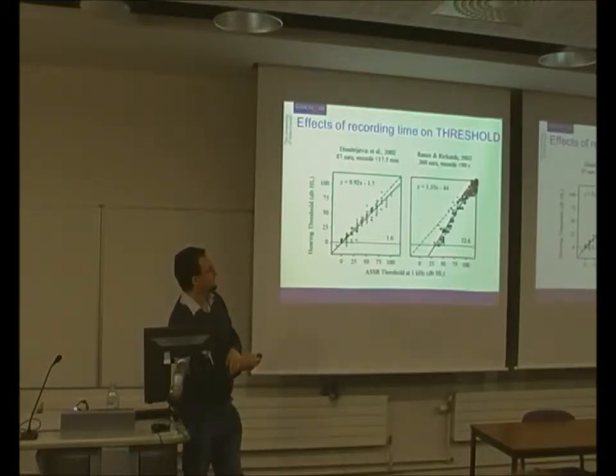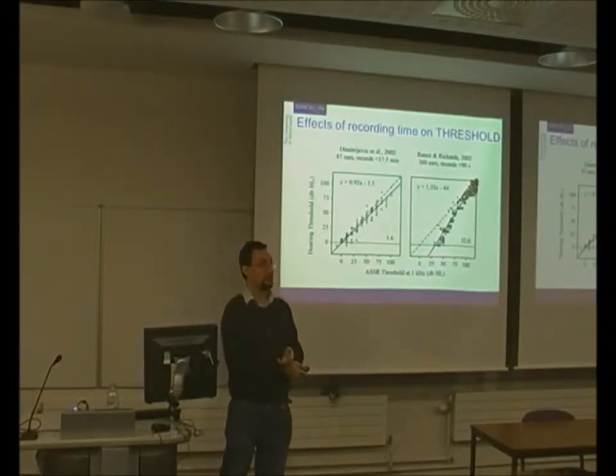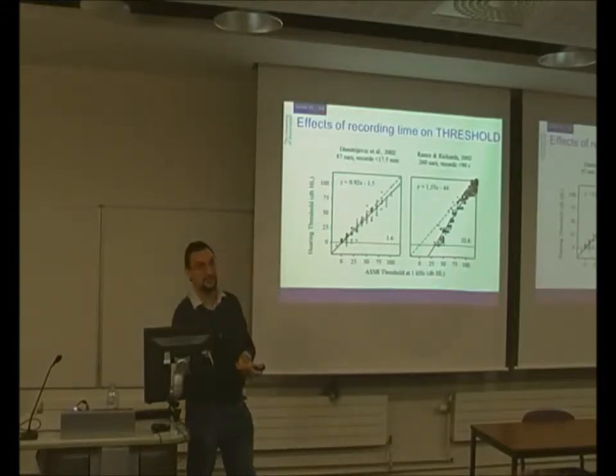And you can see that that represents the sort of noisy situation where the thresholds are a little bit raised compared to behavioural thresholds. Although actually these were infants, and they were very young infants, so the noise conditions were pretty good in those recordings because they were sleeping neonates. So that's a good recording condition anyway.